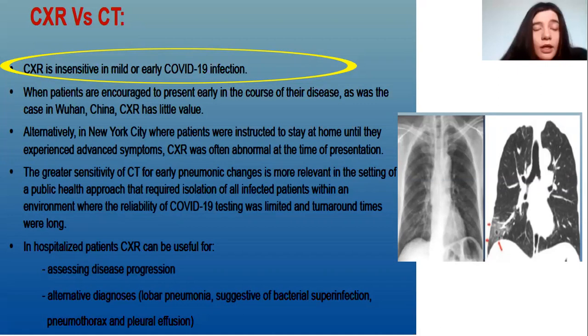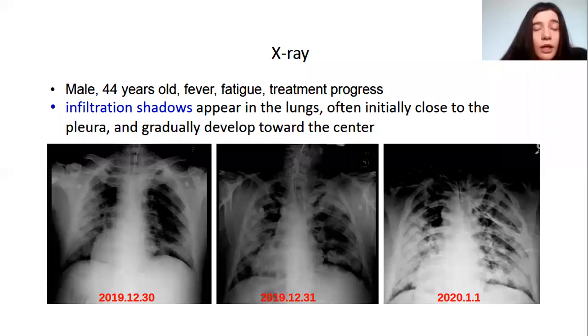Here we have a case of a 44-year-old male with fever and fatigue who is on treatment. We can see first that the infiltrations are more peripheral, then with time they go more to the center, as we see on the chest X-rays.